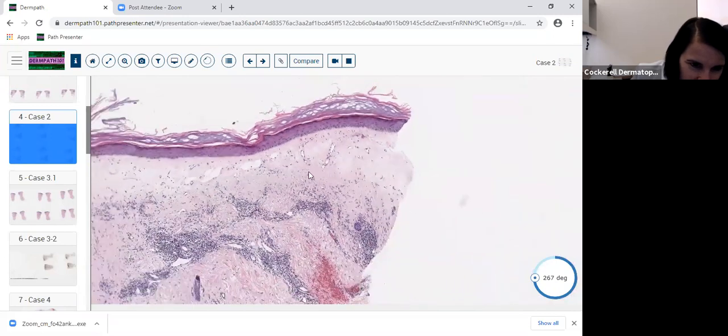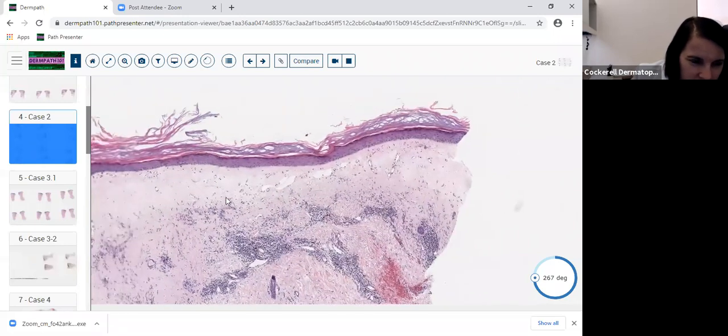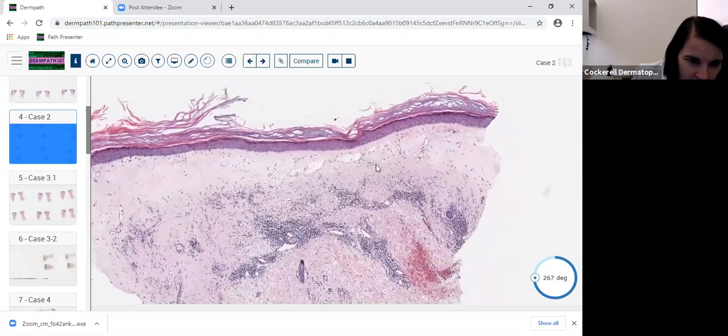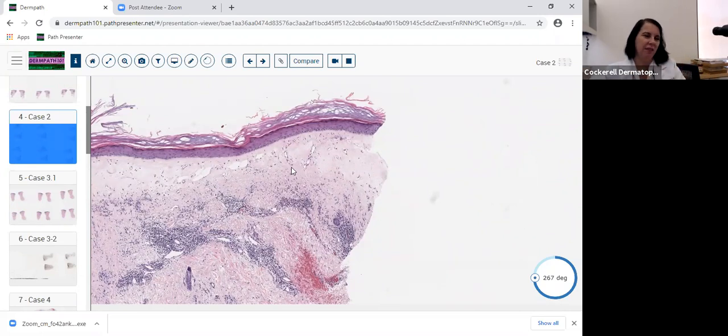The first thing you need to really look for, if you are suspecting this is lichen sclerosis, is you need to look at this tri-layer appearance. You have hyperkeratosis here, atrophy. We don't see much hydropic degeneration, but you do see the pale homogenization of the collagen, and then you see this layer and this patchy band-like area of inflammation. This lesion is sort of in the middle of its course.